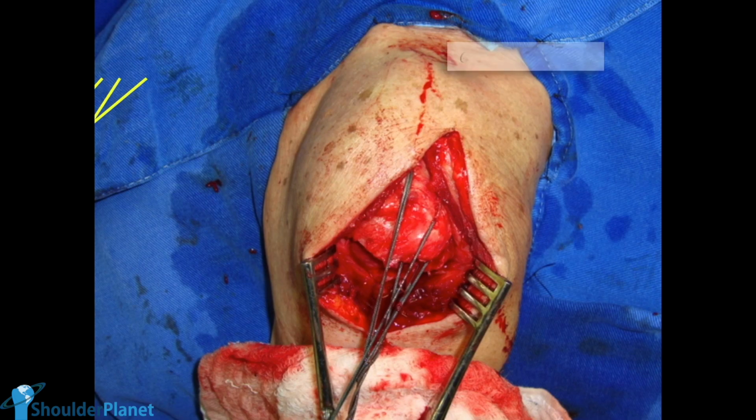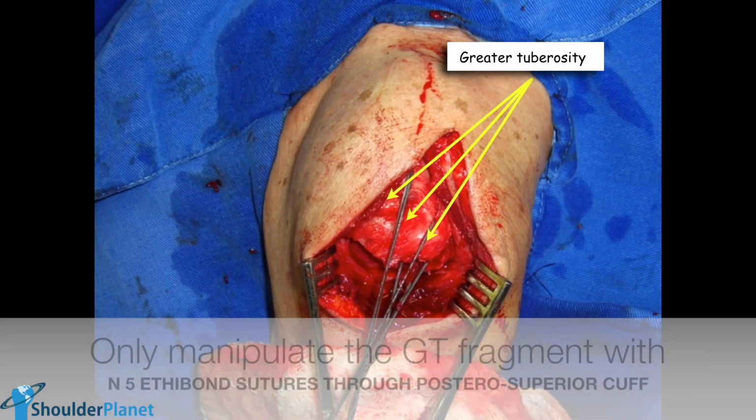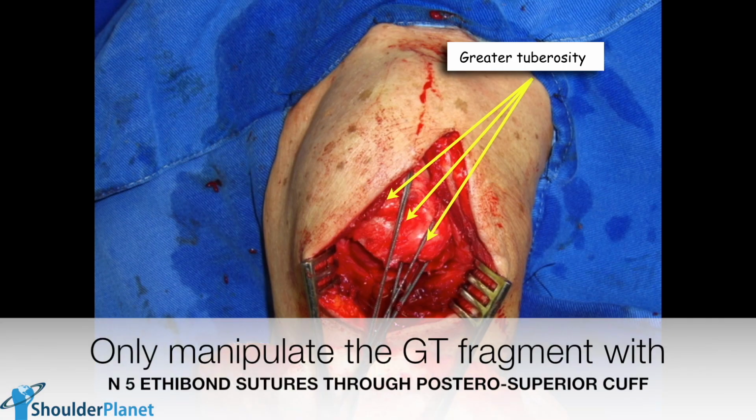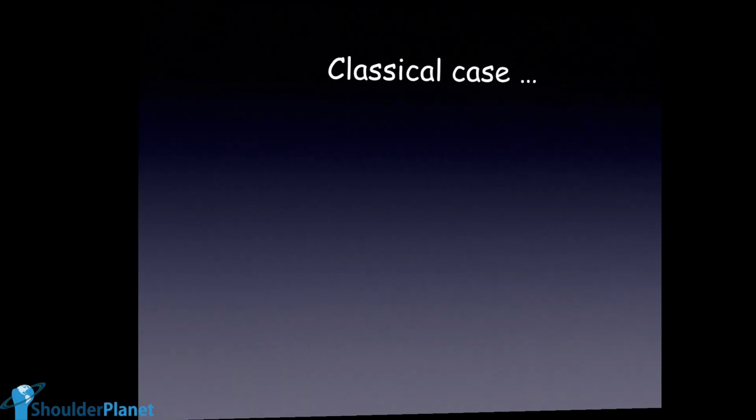And this is another view of an extended deltoid split in a very old case that I did many years ago, in which here we see the greater tuberosity, and there is a message in this photo, which is: you shall never manipulate the greater tuberosity fragment with instruments because it's a very fragile bone. So you always manipulate greater tuberosity fractures with whip stitches, as we are seeing here, as horse reins passing through the posterior superior cuff, the supra and the infra, as we are beautifully seeing here in this picture.